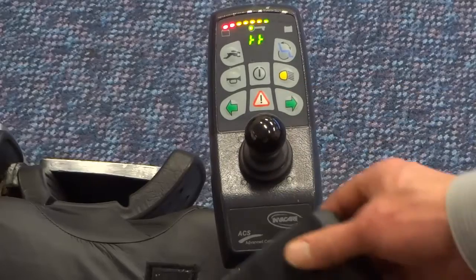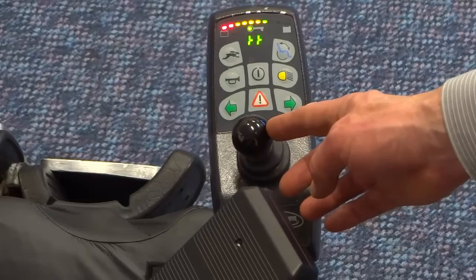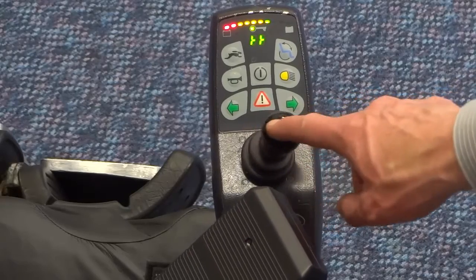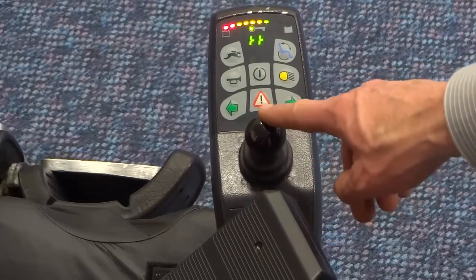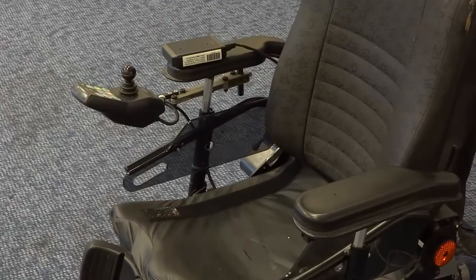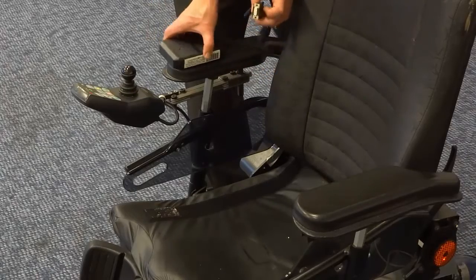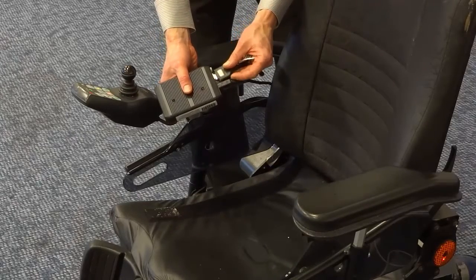There are two modes that the DX ECU can be set up as: one with mouse mode on and the other mouse mode off. With mouse mode on, the deflections of the joystick will momentarily control four different relays.